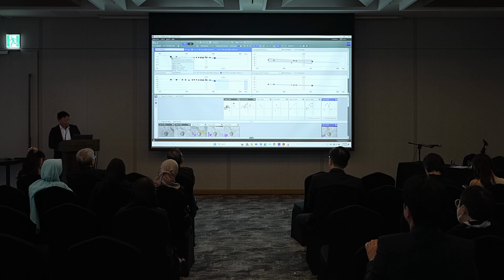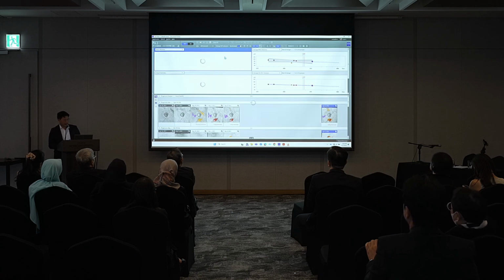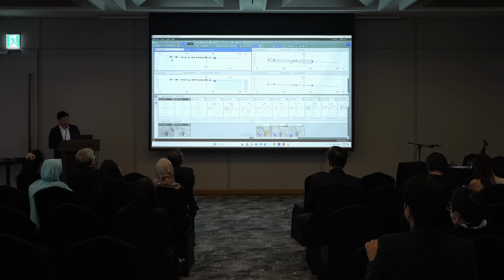The other way to do it is to actually click and drag. So this is what I like to do as well if the patient's had surgery. So let's go back to a non-dual baseline. Here's that view that we saw originally, and here's where the patient had surgery. You can actually click on the dot and literally drag your baseline onto where you'd like to set things. So here we're going to click and just drag onto this dot here.